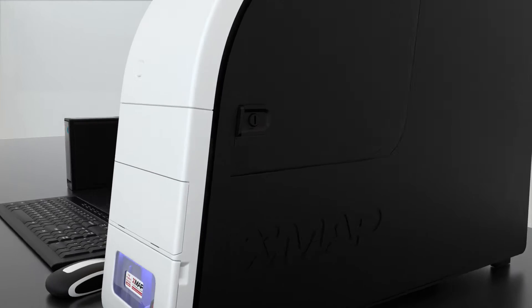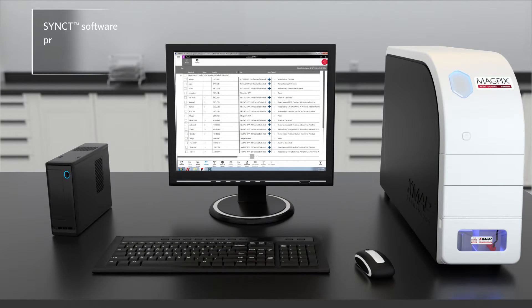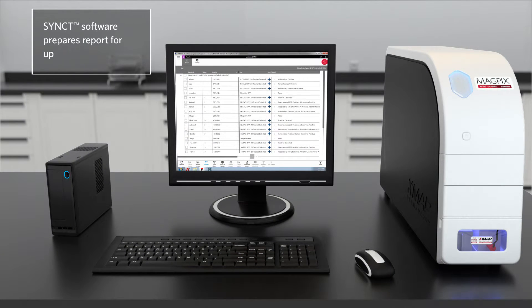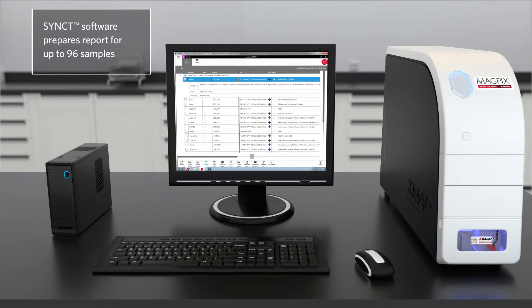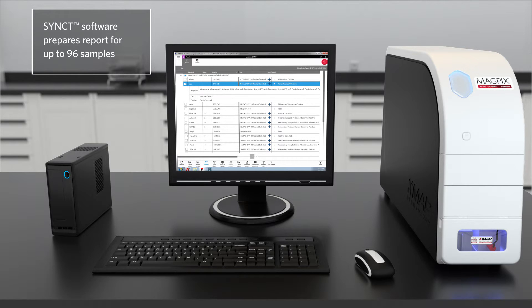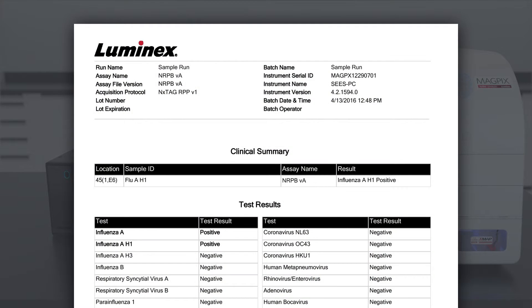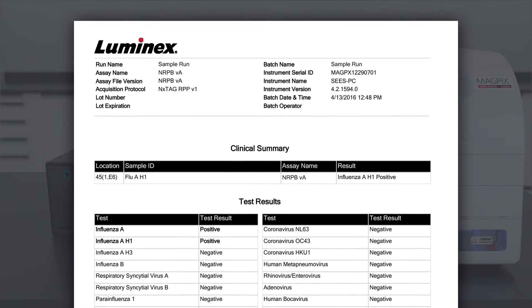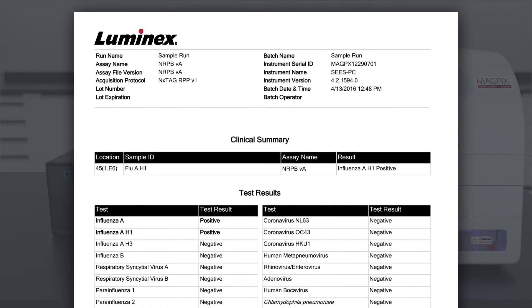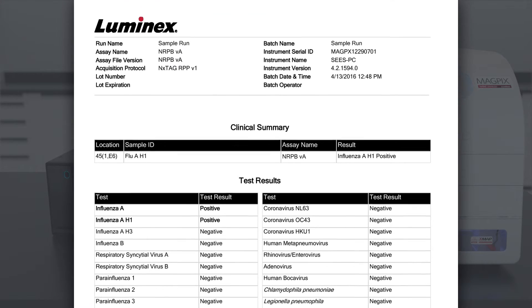At the end of the run, Luminex's SYNCT software prepares the report for up to 96 samples, or can focus on a single result. The reported pathogens can also be customized to the physician's order.